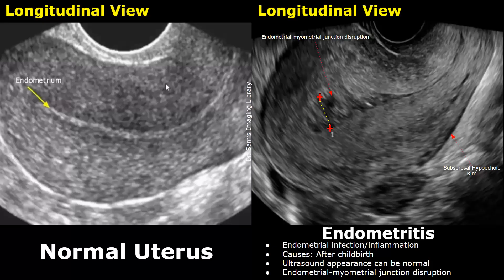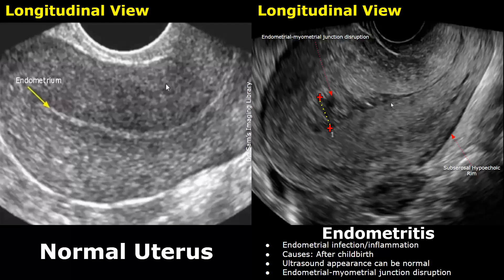The first case is endometritis. The most common cause of endometritis is after childbirth. These are transvaginal images showing the uterus. The image on the left is of a normal uterus in longitudinal plane — the endometrium is smooth and hyperechoic. The image on the right is of endometritis. Ultrasound appearance of the uterus can also be normal in endometritis. One of its features is disruption of the endometrial-myometrial junction; we cannot clearly see the junction between the endometrium and myometrium. The endometrium is not clearly seen — it is heterogeneous in appearance and appears thickened.